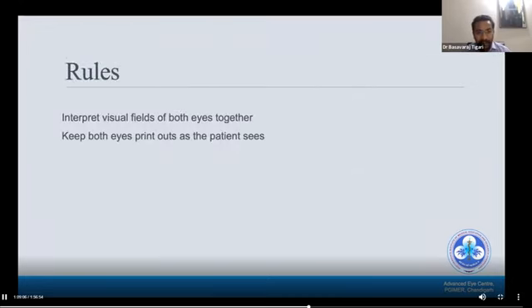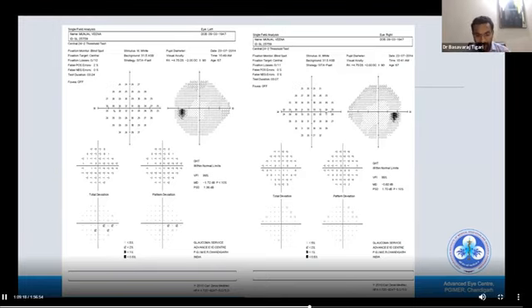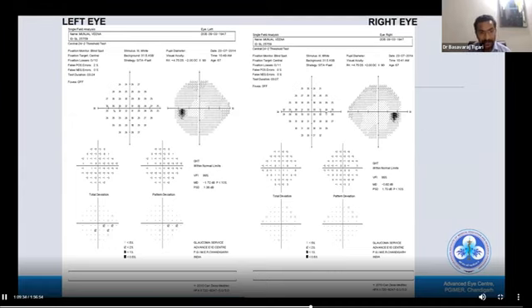Now we move to how to approach a case systematically. The rules: always interpret visual fields of both eyes together. Keep both printouts as the patient sees — right eye printout on your right side, left eye printout on your left side. This is a common source of confusion even for experienced clinicians. It's simple: right eye printout on the right side of yours, left means left side.